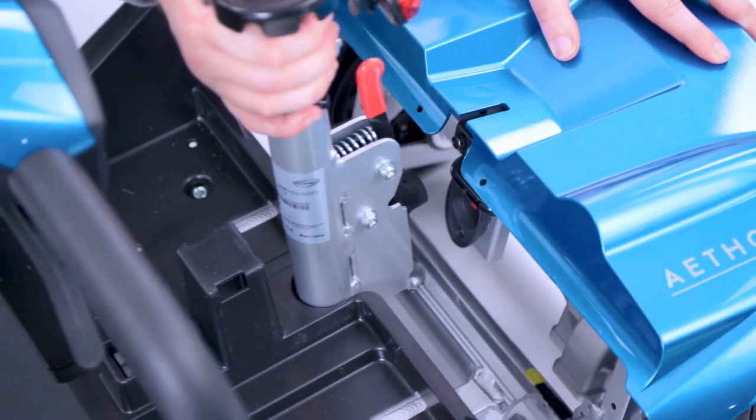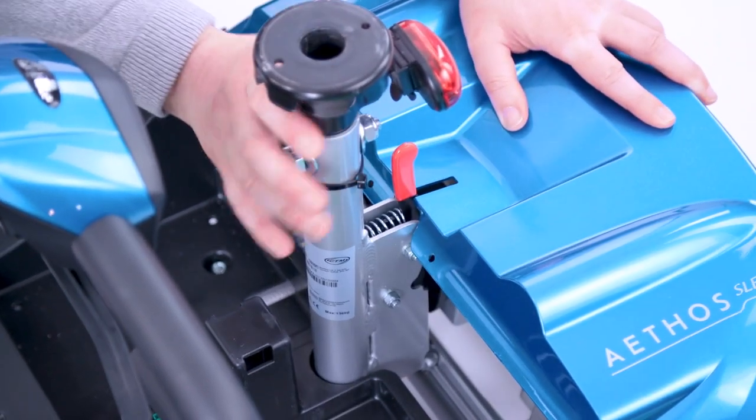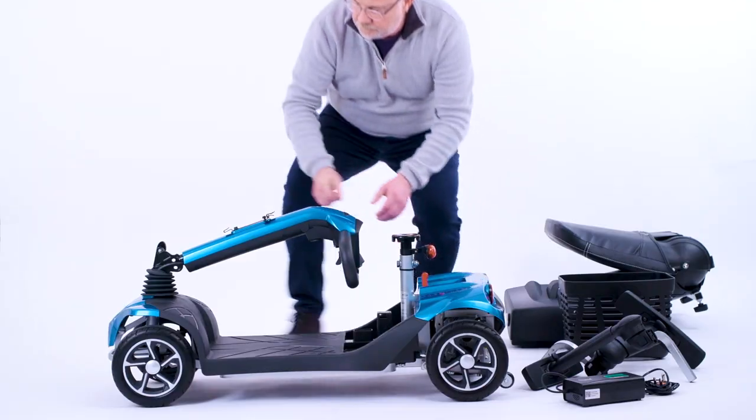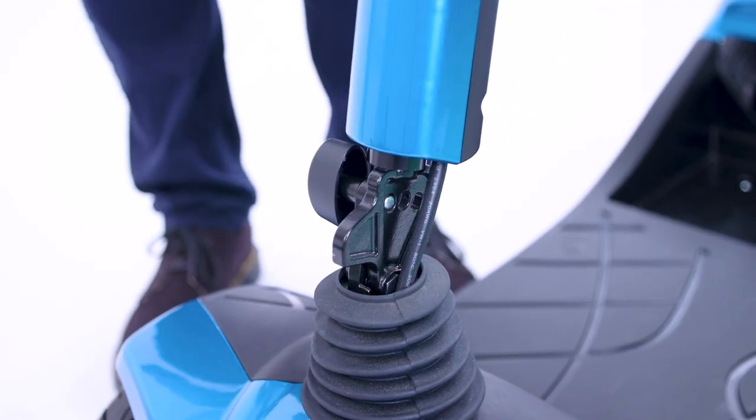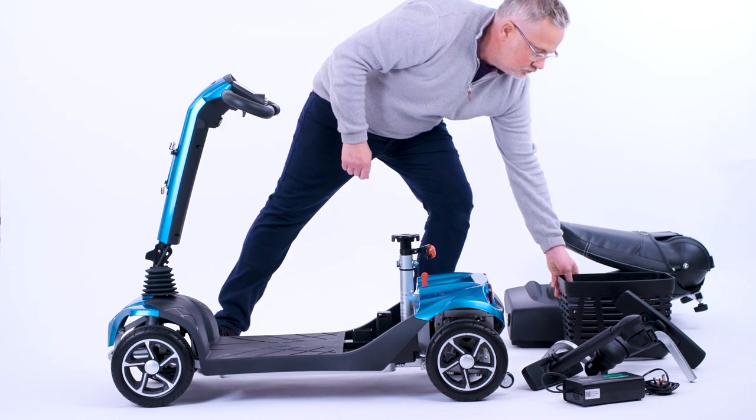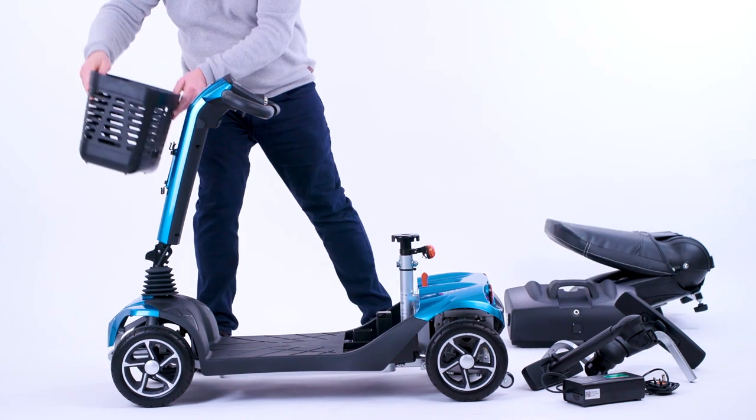Attach the front section of the mobility scooter onto the rear. Lift the tiller until it's upright and clicks into place, and then attach the basket to the front of it.